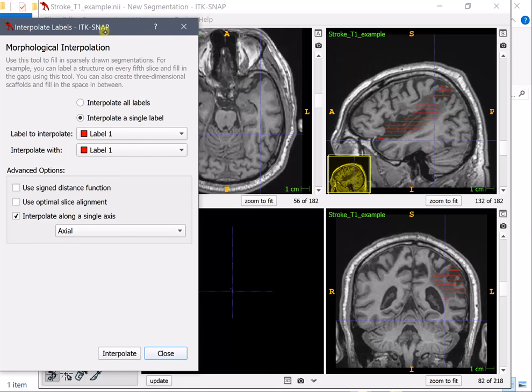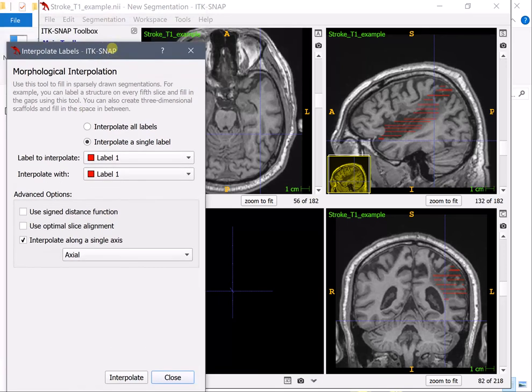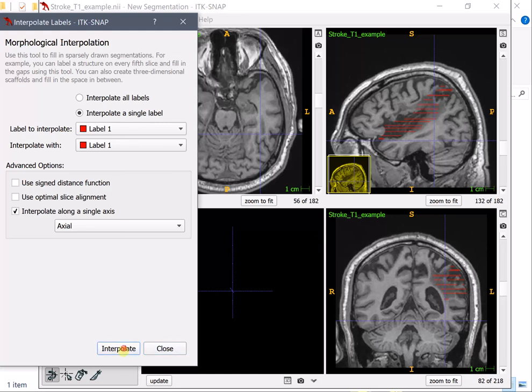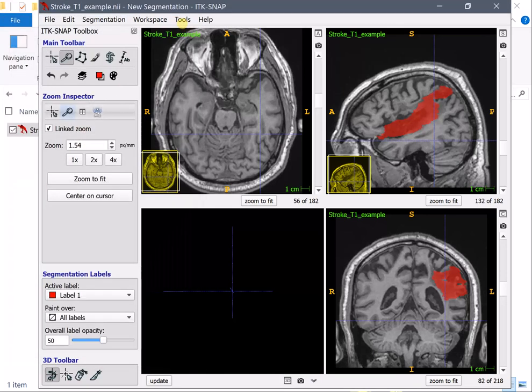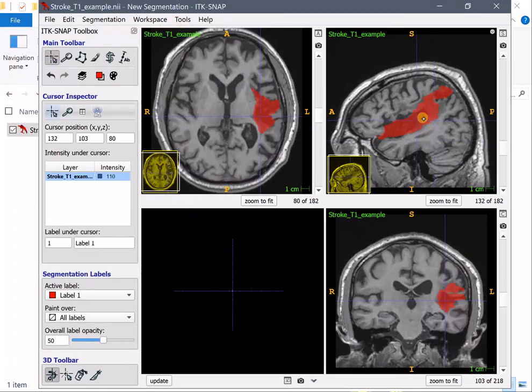Okay I'm back at the interpolate labels which is under the tools menu we'll interpolate along a single axis and that will be the axial because that's how we drew and let's make the interpolation and voila this is the lesion segmentation let's switch back here.